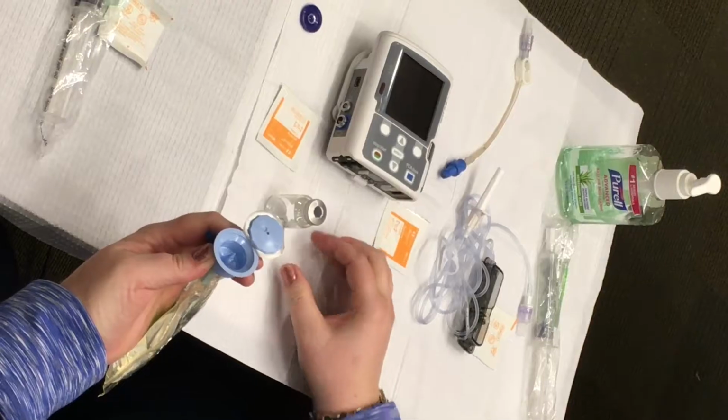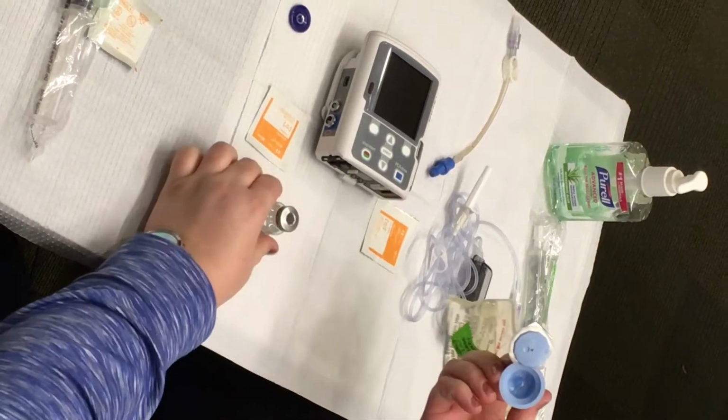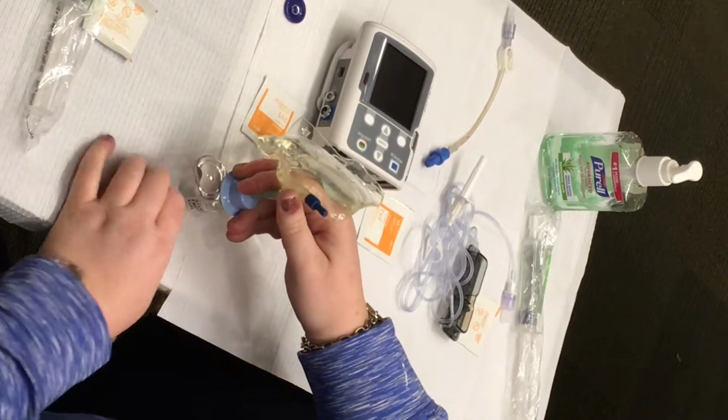Hold the medication vial securely on a flat surface with your non-dominant hand. With your dominant hand, grasp the blue adapter of the mini bag and firmly press the adapter onto the top of the medication vial until you hear and feel an audible click.